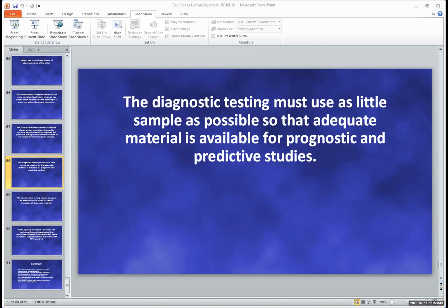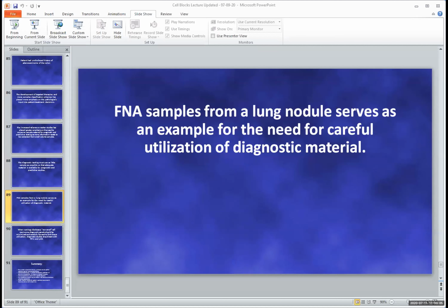Now, clearly, if you have a very specific idea from the cytomorphology, those panels aren't necessary. You just order the few immunohistochemical stains that confirm your H&E diagnostic impression, but it's very important to keep as much tissue as humanly possible so that you can run predictive markers.